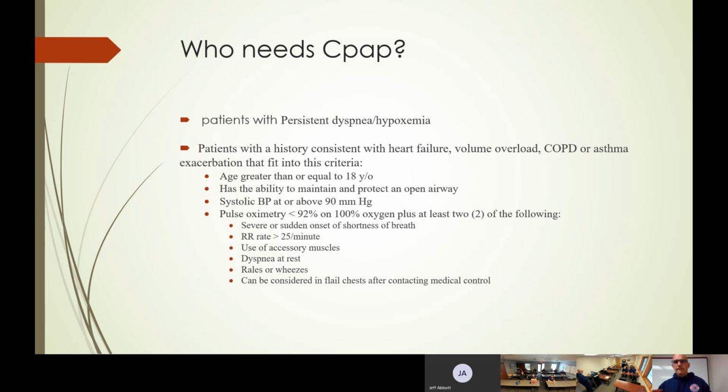On the portable oxygen tanks, did we ever figure out how long those could last? I do not know. Lynn, you got anything on that? What's the duration for a portable tank on CPAP? It's an on-demand system. So it's continuous oxygen, but it's only going to give them as much as they need. So most people, probably about 10 minutes. Okay, that's a good point that hasn't been brought up yet. If for whatever reason we're delaying the transport while we're administering this care, then we need to be thinking about spare bottles and having more coming in or ready to go to switch out. That's good for us up here because we have the one and then a spare.